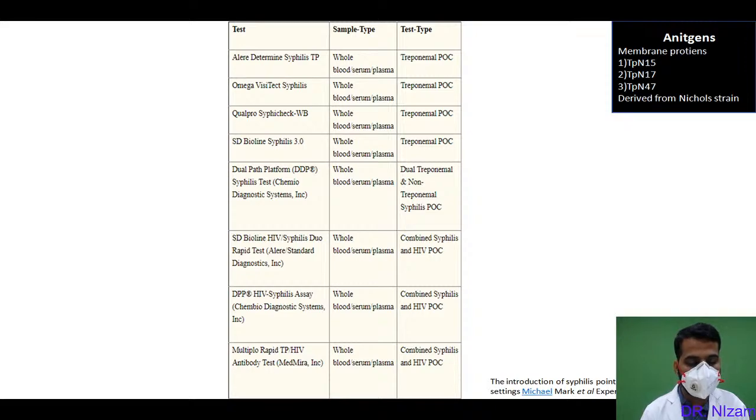Dr. Rathod wants to know what tests are done to evaluate congenital syphilis. You will come to it. Yes, congenital syphilis. Okay. Dr. Roslin wants to know what is the major advantage, apart from what is listed, of VDRL over all the treponemal tests. That is, it can detect the active infection first, and the second is it can monitor the treatment therapy. This is the major advantage of the VDRL. Anything else? It can be performed at a basic laboratory. Leave it.